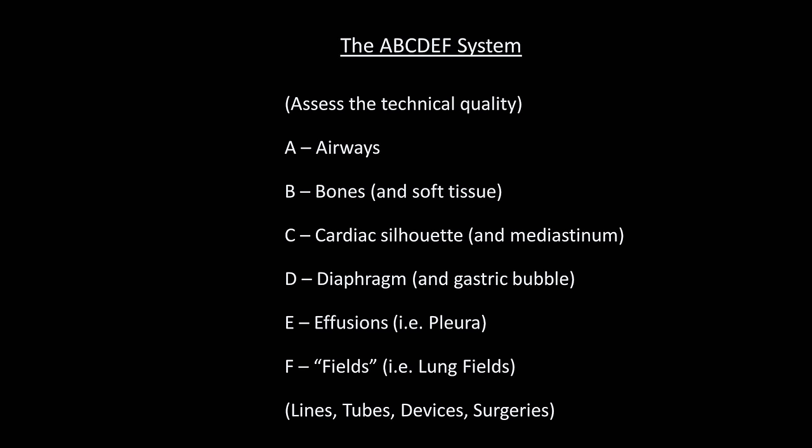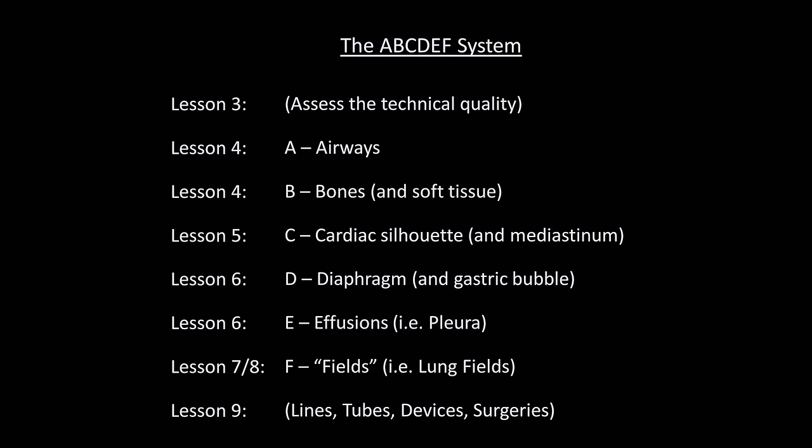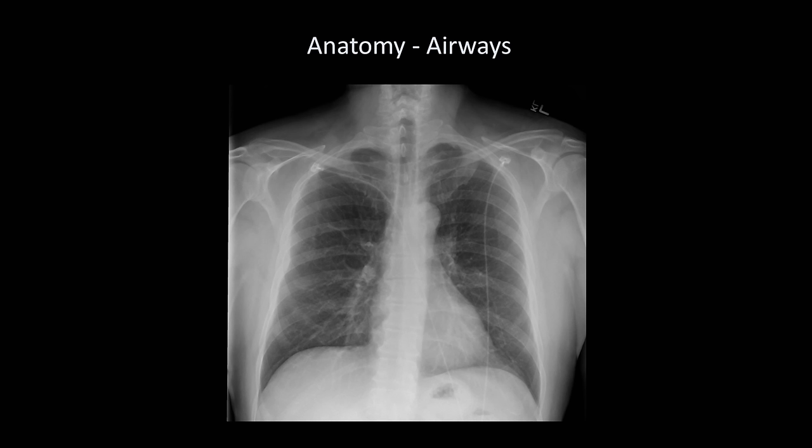You may have noticed that the list of items here lines up with the remaining videos in this series, which of course is not a coincidence. But before you can identify pathology of each of these anatomic structures, you first need to know where they are on the x-ray and what they normally look like. So let's go through the x-ray anatomy of A to F, one at a time.